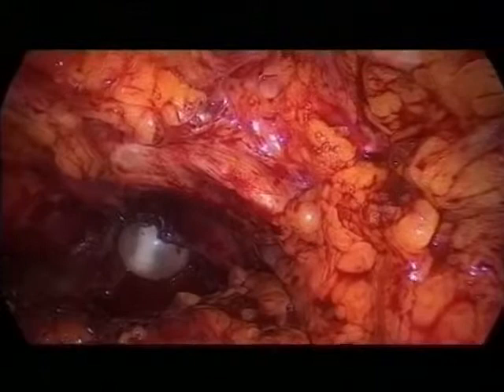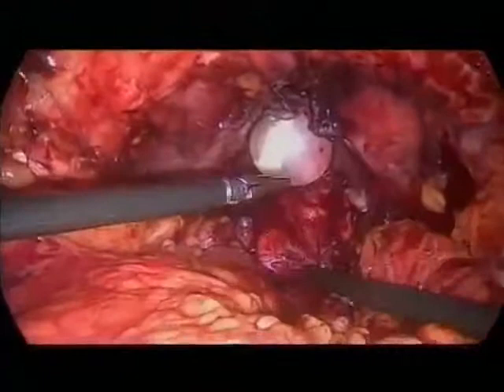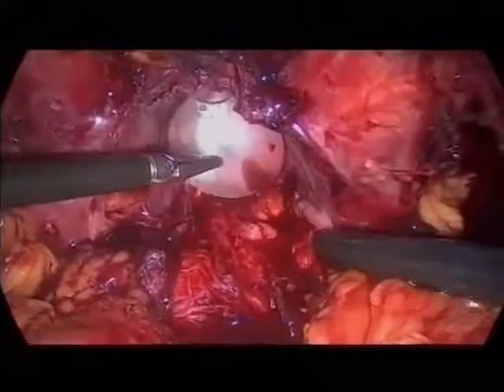The prostate is out. We removed the whole prostate. It's not here, you see. And we removed the whole prostate. The catheter is blocked here. There's a little bleeding here on the right side. We stop it with the balloon.